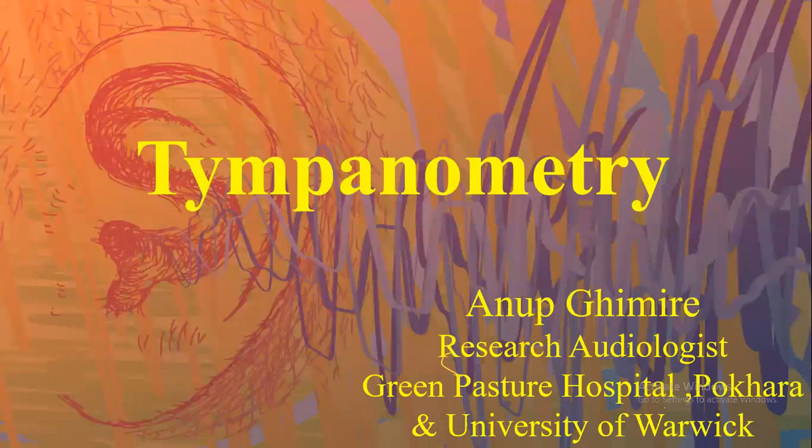I feel like tympanometry is a most fascinating and very fast test to perform in audiology. As we all know, we have gone through the pneumatic otoscope, where we observe the tympanic membrane movement with the applied pressure. Unlike that, in tympanometry we use varying pressure, but we are not trying to observe the movement of the tympanic membrane. In this process, what we are observing is, with the varying pressure, how much energy is passing through our middle ear system, and how much energy is reflecting back.